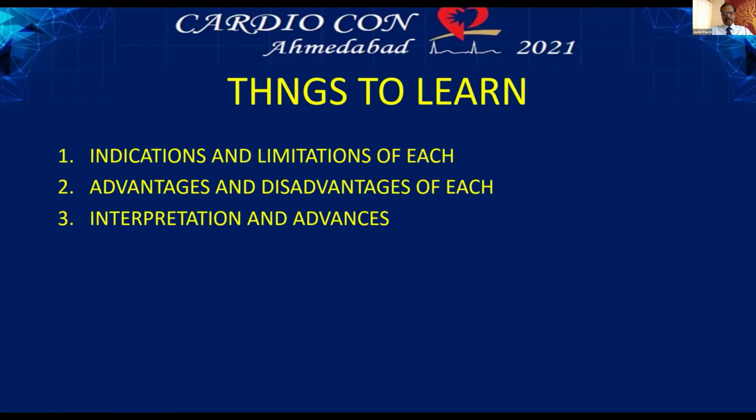And he showed very good images of left main, where 4.5 millimeter of left main was imaged very nicely with the OCT. And he also highlighted the fact that IVUS and OCT have very good co-registration facilities, so the ability to pinpoint the place where you can treat. And lastly, he hammered the nail in the coffin that when there is a need to avoid contrast, you can still manage very nicely with saline.